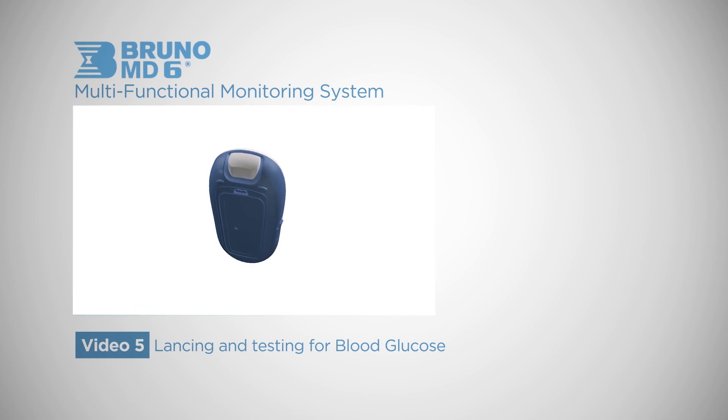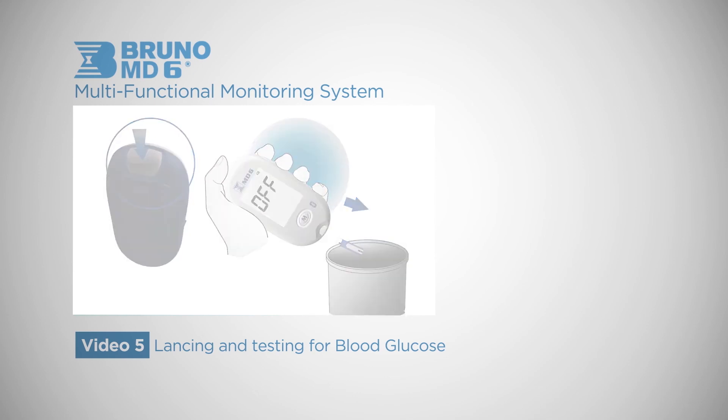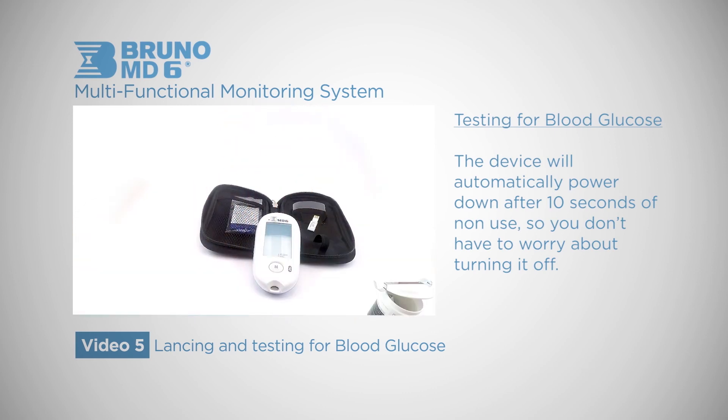When you have finished testing, you can safely dispose of the strip by holding it over the trash and hitting the eject button. The device will automatically power down after 10 seconds of non-use, so you don't have to worry about turning it off.